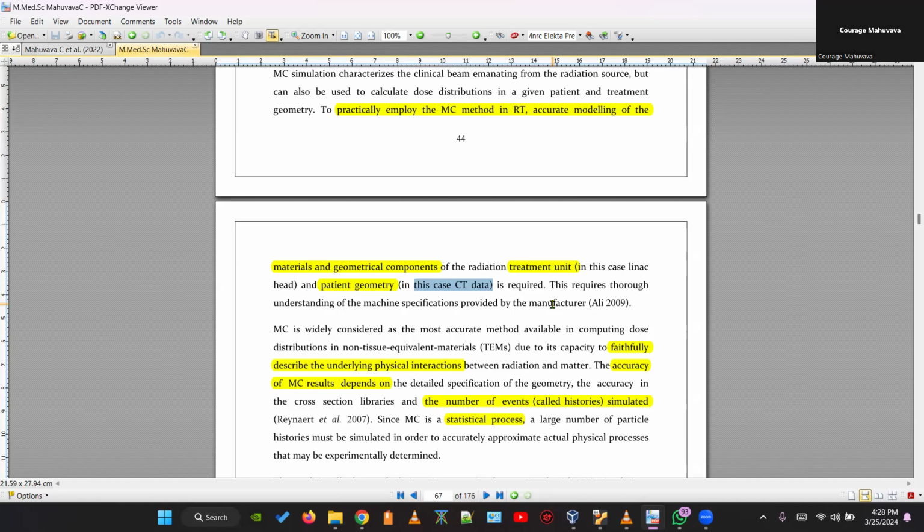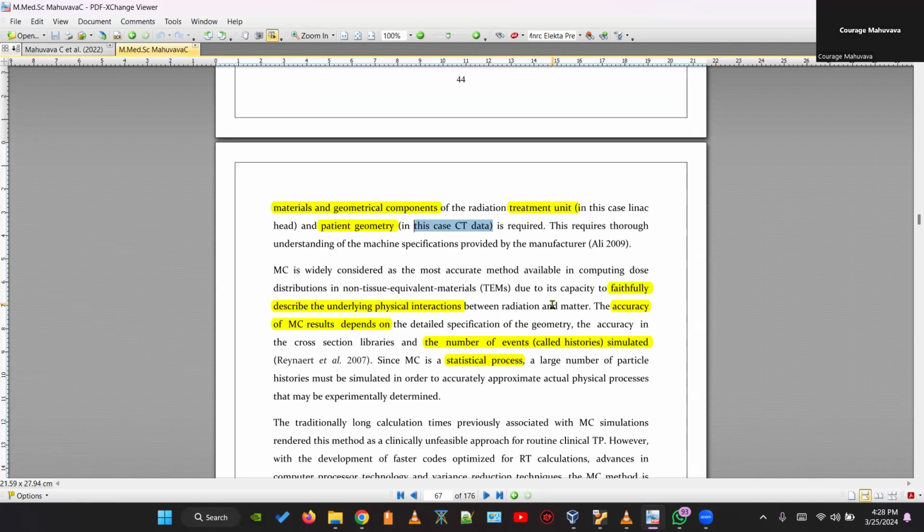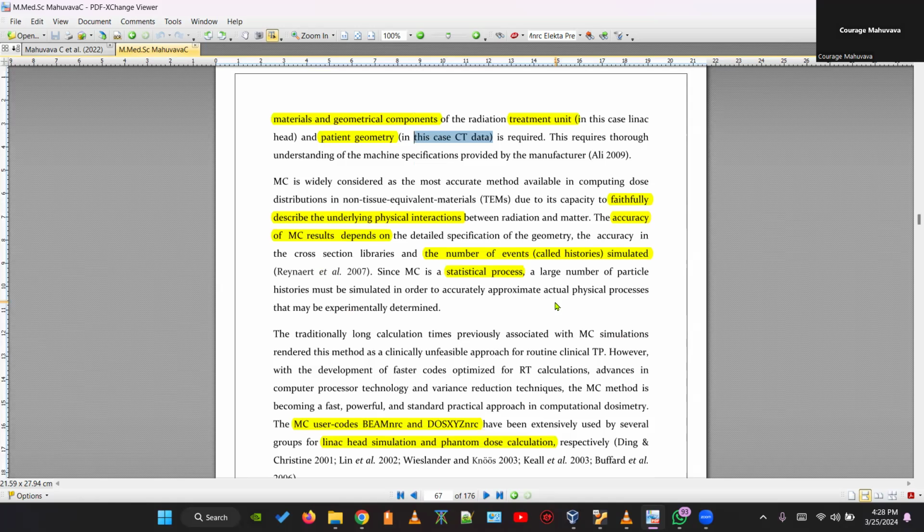So you simply take those CT slices, you can combine them into a single file, which is in the format compatible with e.g. EGSnrc, or specifically with DOSXYZnrc. And then you can run your beam from the linac through the patient and calculate the dose. All right. And you can calculate now things like PDDs, dose volume histograms, profiles, and other things. All right. So this is sort of a summary of the process.